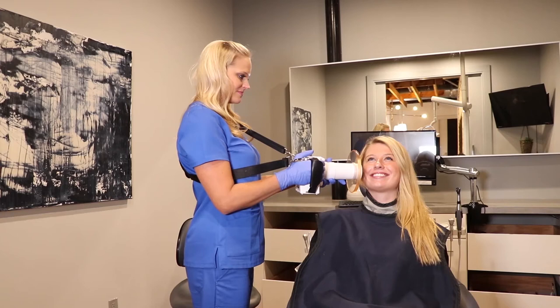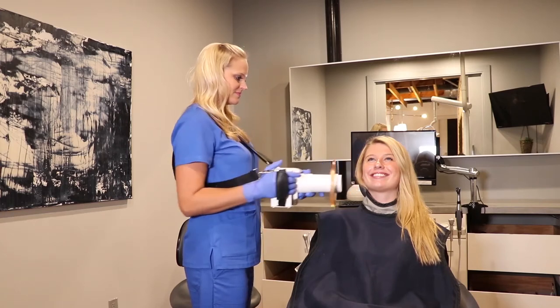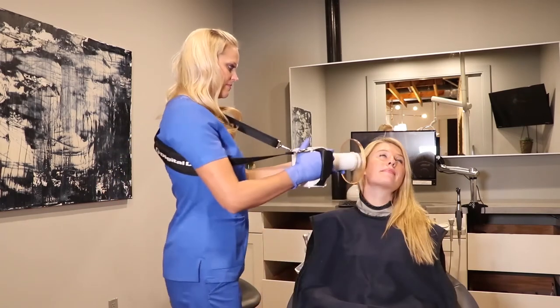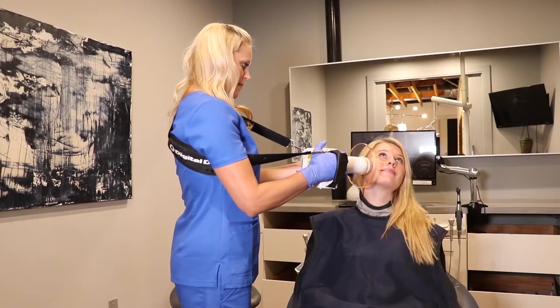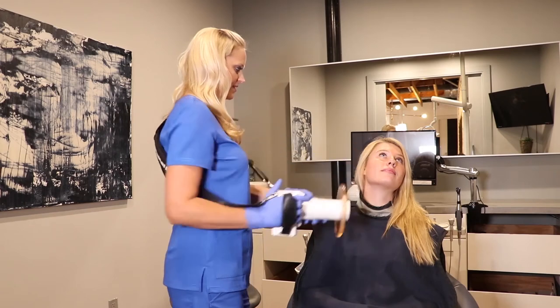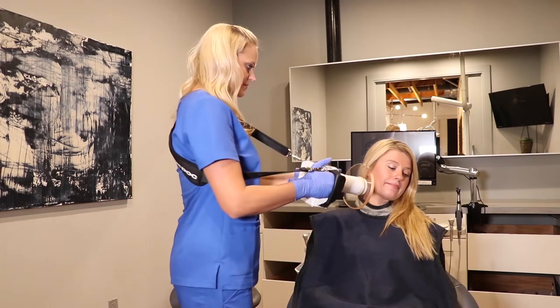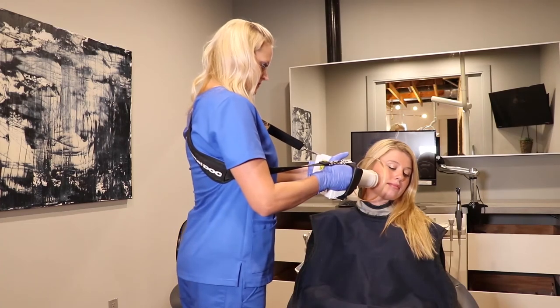Bite wing image. For the bite wing, just keep your patient looking straight ahead. These next two positions may be exaggerated for demonstration purposes. The posterior mandibular PA, the patient will tilt their head up and to the side. Posterior maxillary PA, patient will tilt their head down and to the side.